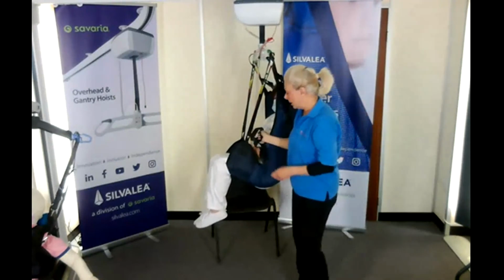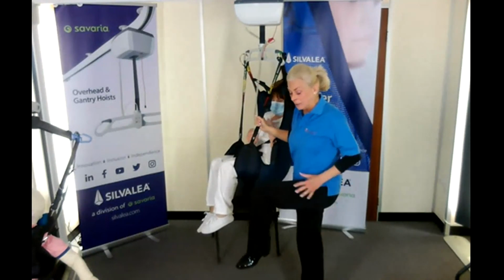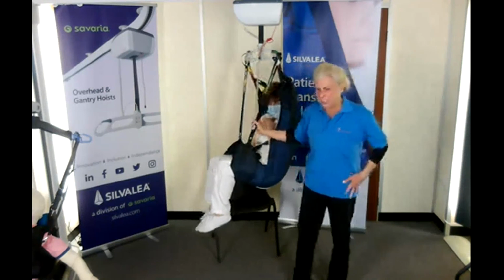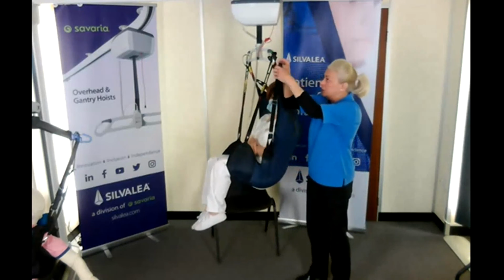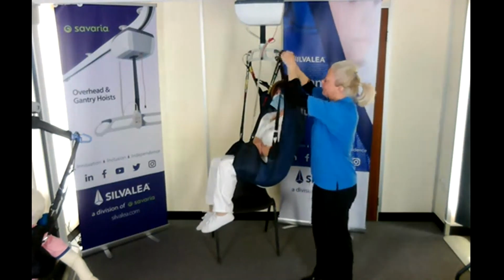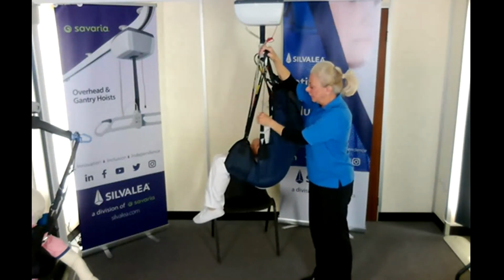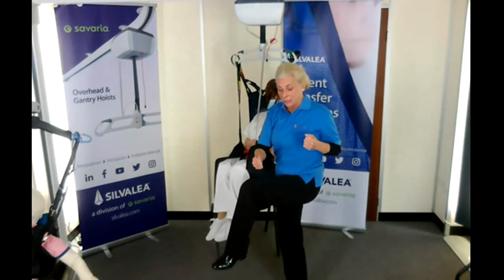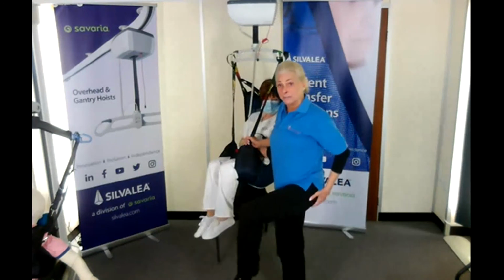So if you've got a situation whereby you've got someone sinking and they need that little bit more support, it lifts the hip, distributes the weight, and it will take pressure from behind the knee. Ideal for anyone that's got arthritis or pain in the hip area. So just to lift. And they are on the slider, as we've talked. I'd have to lower Judith down just to get it on in the right tension, but you just adjust it to the right tension with the slider. And you need to get it to pick up at the same time as the leg, so simultaneous with the leg. If it's too loose, it won't do anything and it will not give any support. If it's too tight, it's going to force the hips up first.